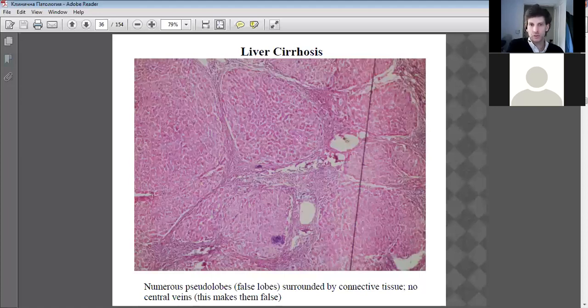Well, the connective tissue is increasing in size between the smaller lobules and the bigger one. Some more there. Okay. Now as these smaller ones grow, they don't have in the center a vein anymore. It's supposed to have a vein in the center of the lobules.